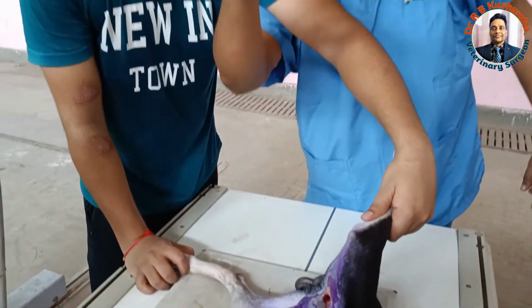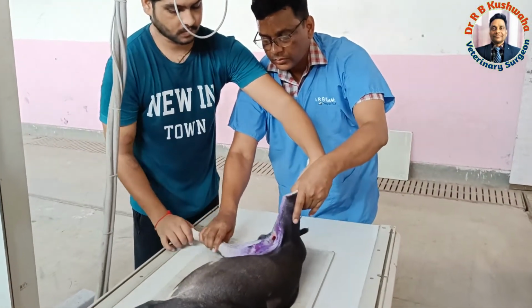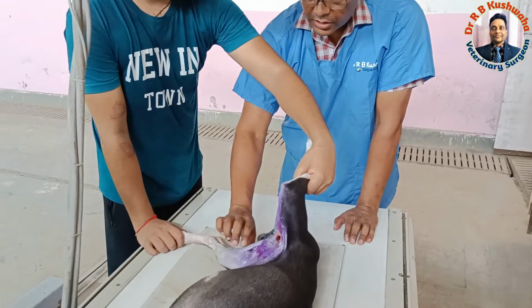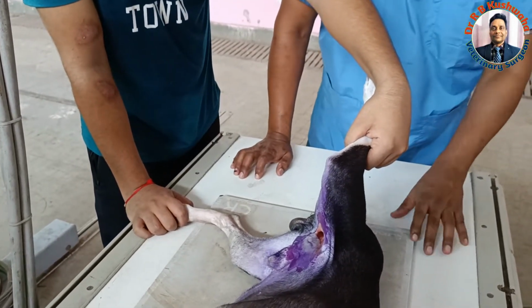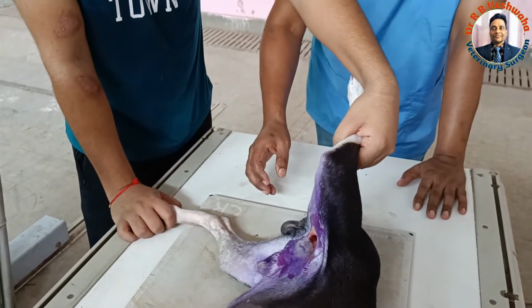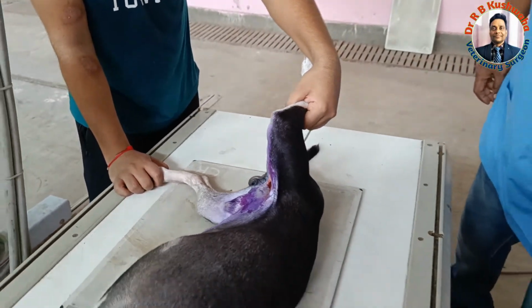Now the center of the beam should be here. We also have this bucky, but the thickness of this thigh area is less than 10 centimeters, so that's why I am not using the grid. Otherwise, if it is more than 10 centimeters, this cassette is normally put here in the bucky.